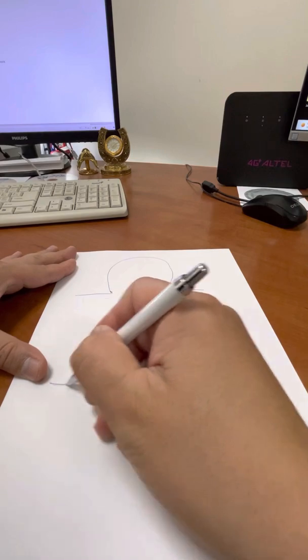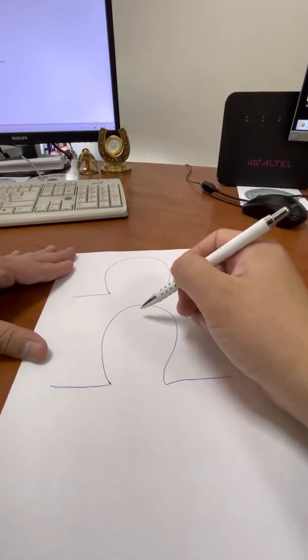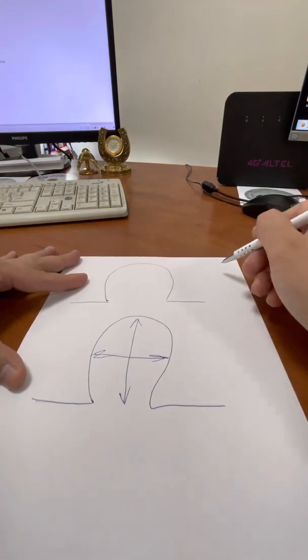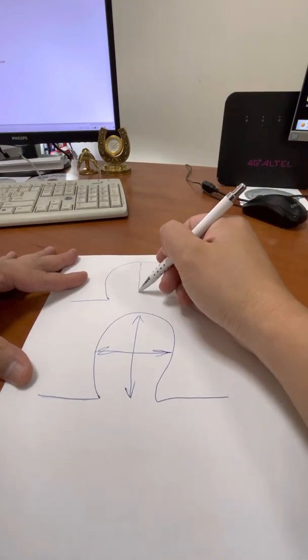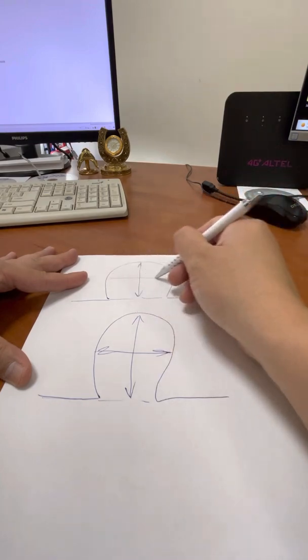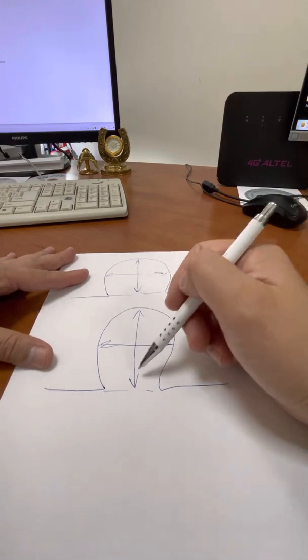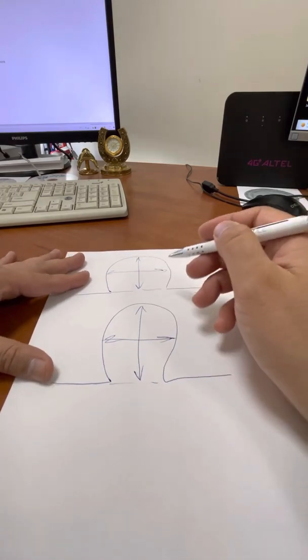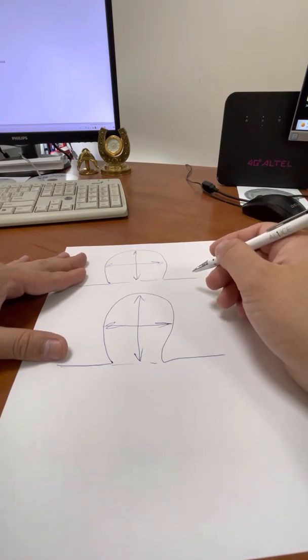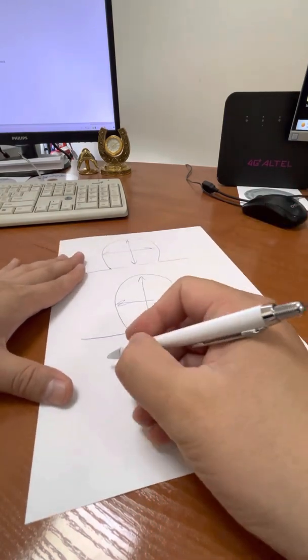This is an aneurysm like this, and this is an aneurysm like this. There's two sizes, usually three sizes. You can take these sizes from the neck and dome, the width of the dome and the height of the dome, and it depends. Every coil has sizes, and the unique coil is Axiom coils.